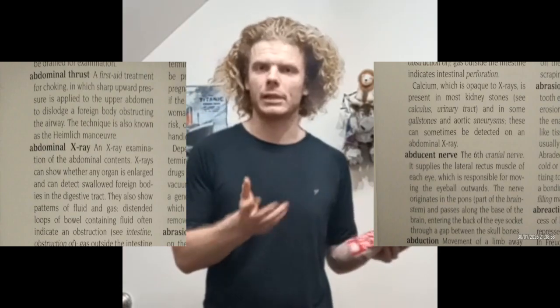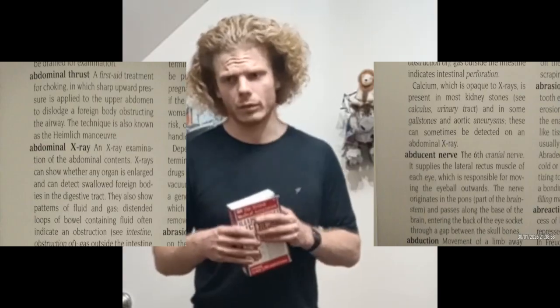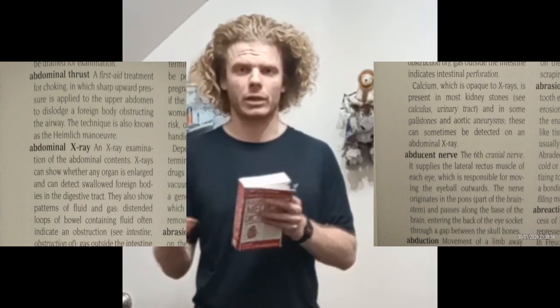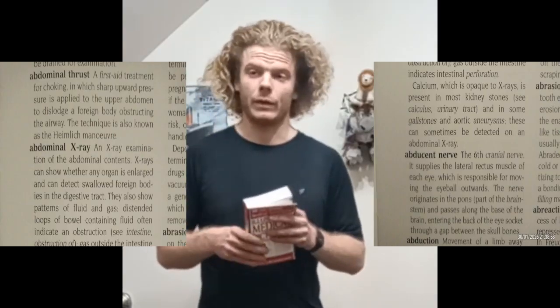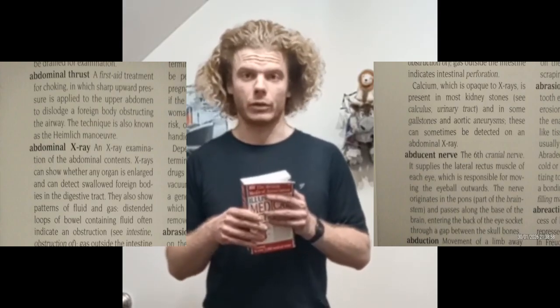Abdominal X-rays. An X-ray is made of the abdominal contents, to see if an organ is enlarged or if someone has swallowed something which should not be swallowed. There can be seen patterns of fluid and gases that can indicate an obstruction of the intestine, or a perforation of the intestine if the gas is outside of the intestine. And calcium is opaque to X-rays, so it can maybe help to find gallstones or kidney stones or also aneurysms.